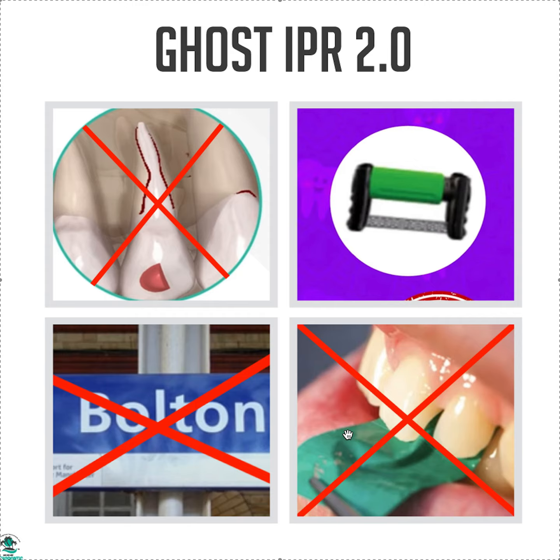Sometimes you have anterior contacts at the end, so you need IPR. So these are needed IPR. So these are not Ghost IPR. Ghost IPR is virtual IPR.